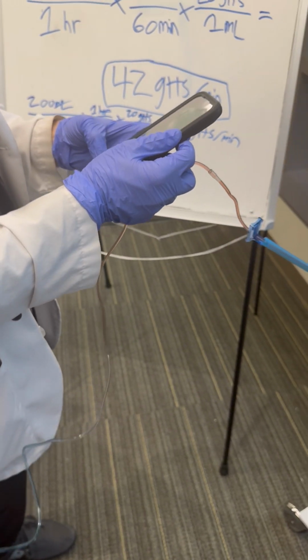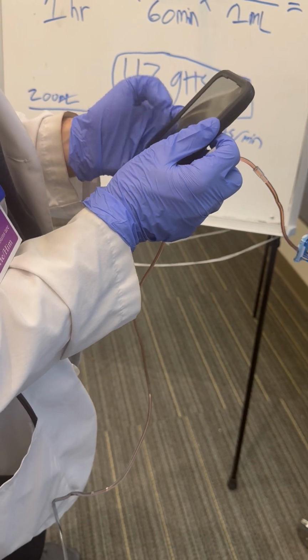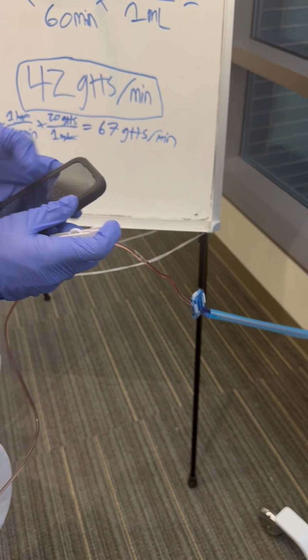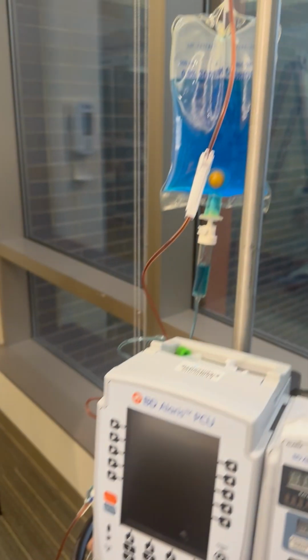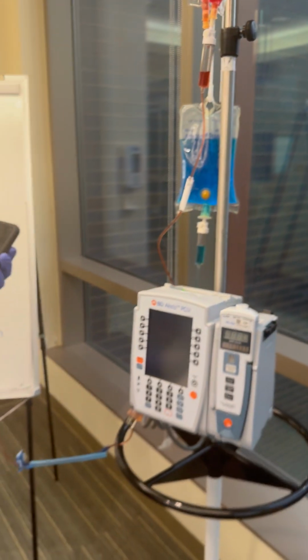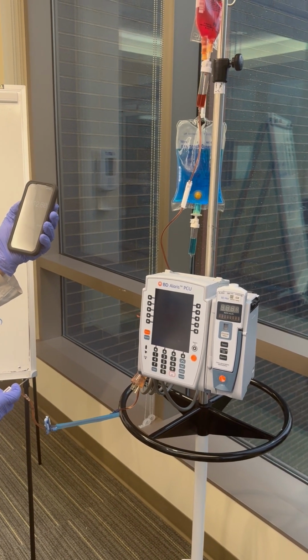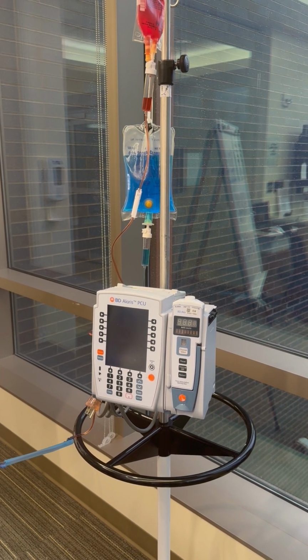Just very quickly here. So about 16 drips in 15 seconds. Slow it down a little bit. It's about there.